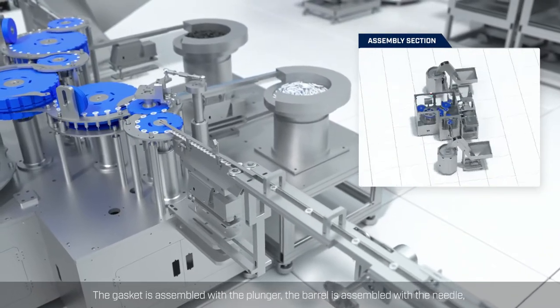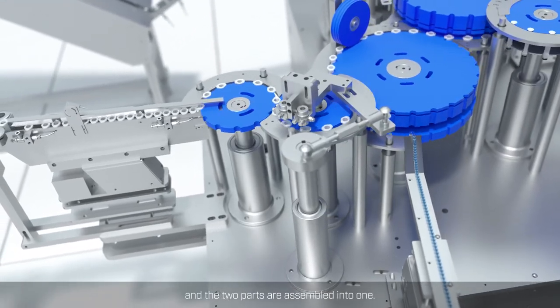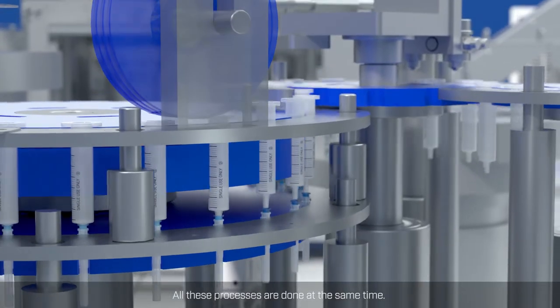The gasket is assembled with the plunger, the barrel is assembled with the needle, and the two parts are assembled into one. These processes are done at the same time.